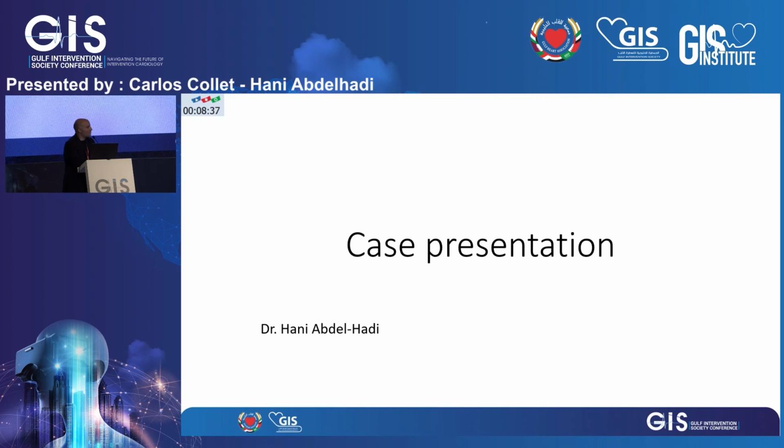On that moment, we want to bring it about. So if we can do something natural, away from the metals, of course it has to be done in a proper way, done slowly, gently, we are able to prevent future restenosis. People talk about the DCB results, the immediate effect. You will not get DCB results in the cath lab. You will get them later on.